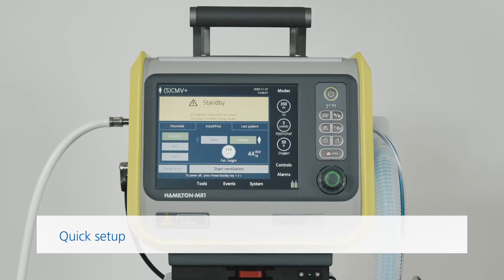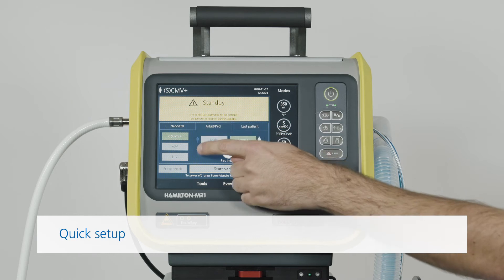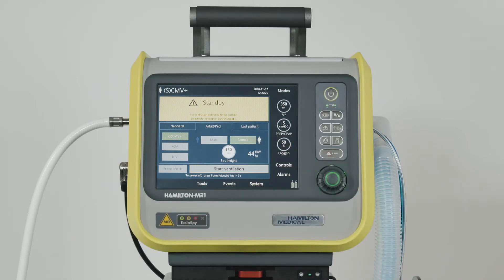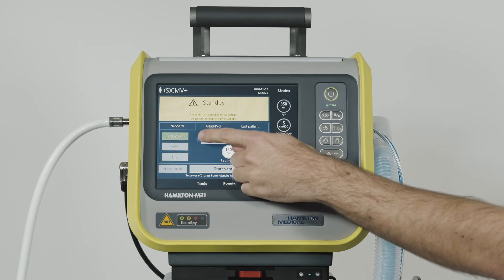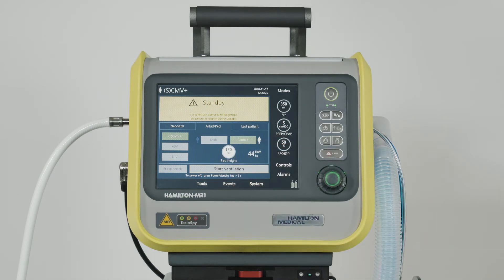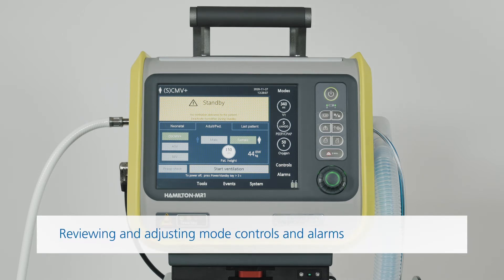For a new patient, you can pre-configure the ventilator quickly just by touching a quick setup button. Each quick setup defines which ventilation mode should be used and all the settings that are relevant for that mode. For each of the patient groups, you can define three different default configurations. Of course, you can always modify any of the settings if you have to.